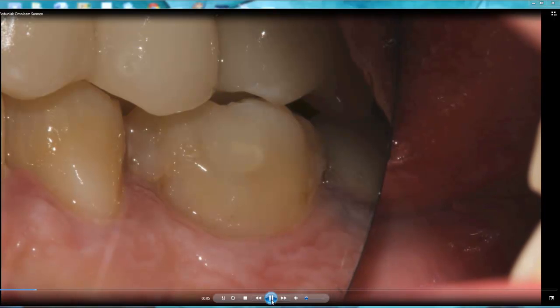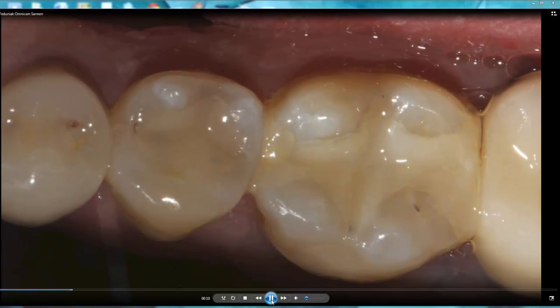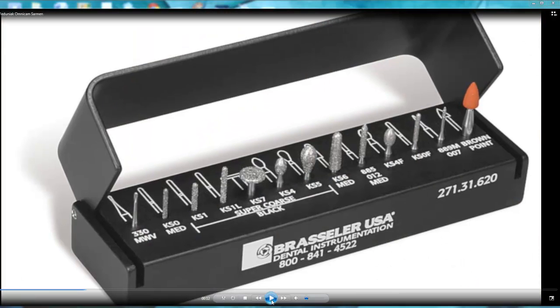This is his buccal view. You can see the occlusal view of those teeth, number 19, number 20. I've been using a Hoist preparation kit, and I use this kit almost every day for almost all the cases, for prosthetics, and the same kit I also use for the surgical part of my practice. You can see the phone number of the bur company, and you see the diamonds I've been using.